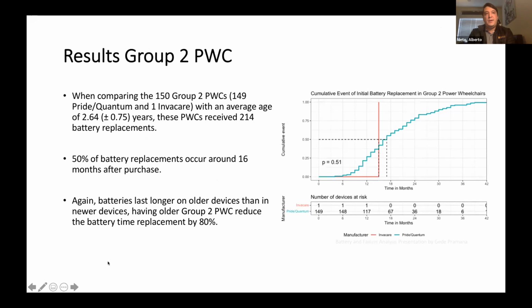I think it can all depend on basically the power of the charger that they're using, and also it's really related to the battery charging habits of the wheelchair users as well. So it depends. I think it's on a person-to-person basis as to whether they are doing the charges that the wheelchair needs every time they need it. So that's why there are some variables that we still need to look at in the future so we can have more accurate information on it.